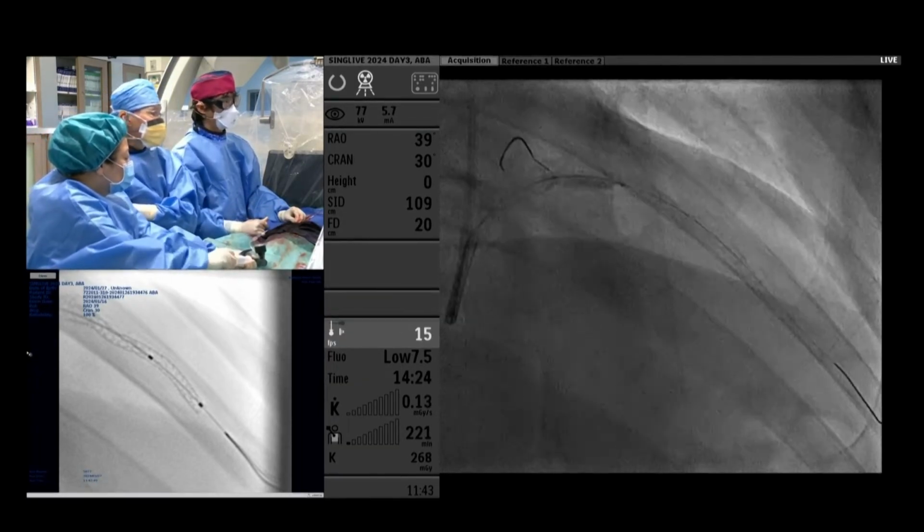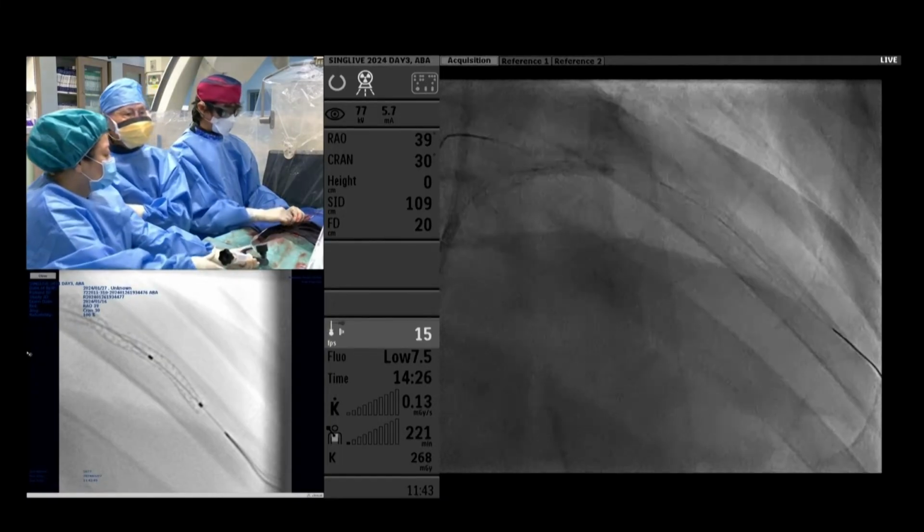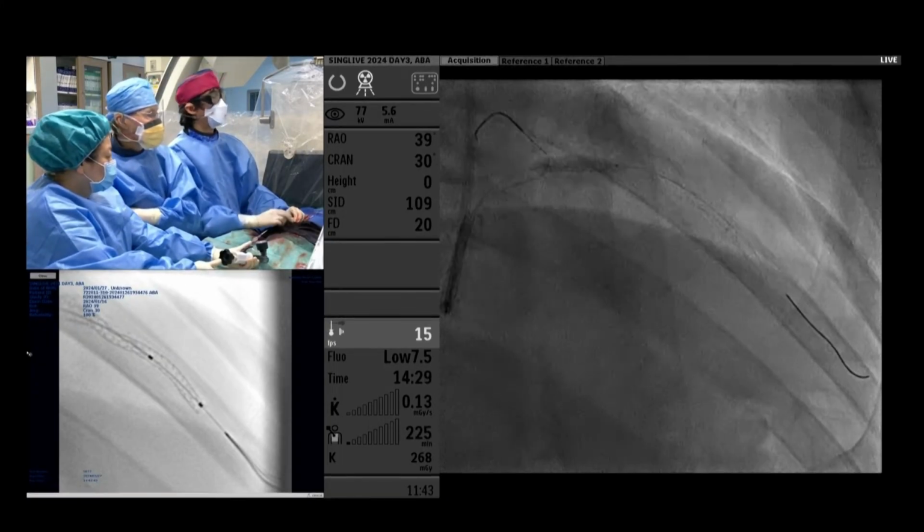So your ectopics have come back, huh? Yeah, I think so. It's intrinsic. It's nothing to do with our wires, I think.